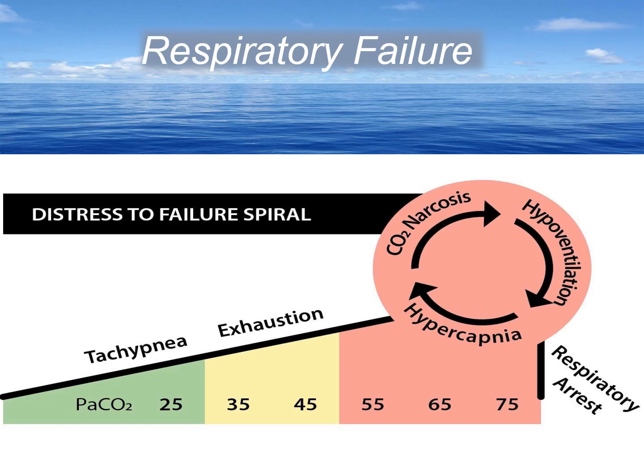You can rapidly assess the end-tidal CO2 trends with respiratory failure, providing sufficient information is available to determine whether the patient's ventilation is worsening despite treatment. In respiratory distress, we're either increasing end-tidal CO2, stabilizing end-tidal CO2, or decreasing end-tidal CO2. One of the most important trends we're observing is acute respiratory distress leading to respiratory failure. Generally speaking, at the beginning of the patient's course of illness, we'll see tachypnea with a low end-tidal CO2. Yes, the photo says PaCO2, but we can still use this image for reference and think of it as end-tidal CO2.